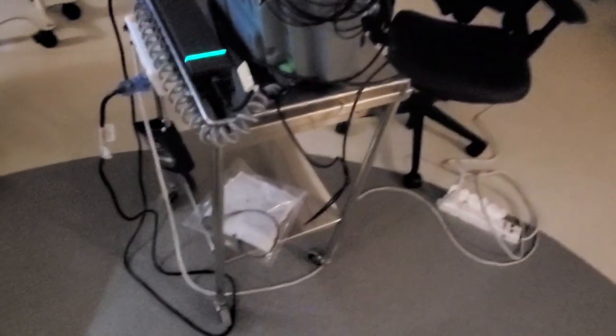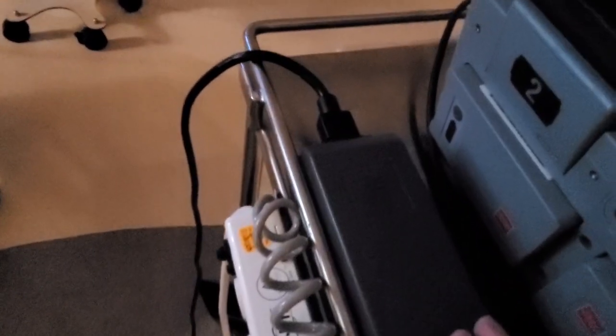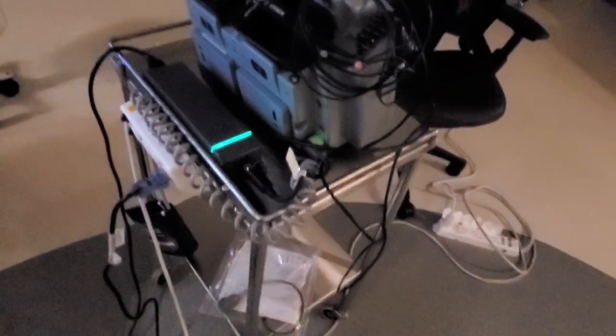Obviously, this guy lives on this cart. If this guy lives on this cart with his power brick, this cord right here will come unplugged. See how it comes up and over like that and then down? This guy is coming unplugged. Yeah, see, and people don't even realize it. Bad juju right there. So guys, there's a whole bunch of ways that we can prevent cable damage.